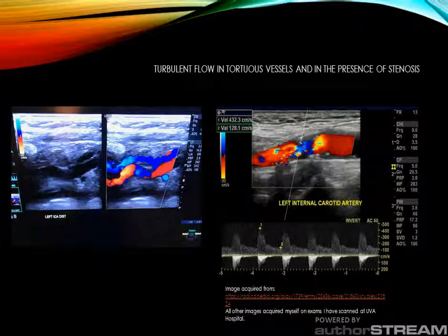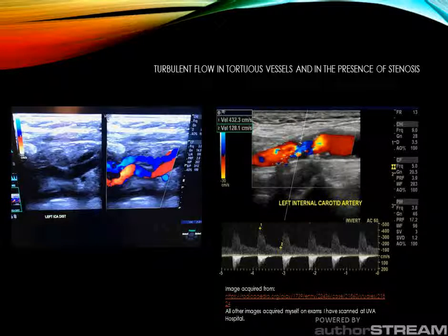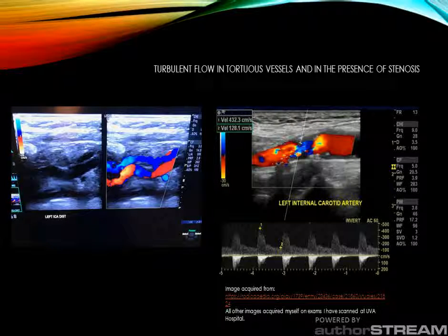We also know from flow characteristics of a stenosis in lesson 3 that upon the exit of a stenosis, turbulent flow is present, and distal to a stenosis, there is a lessening of velocity. This allows the return of laminar flow. I hope you enjoyed this presentation and it helped to solidify your understanding of flow patterns within the extracranial arteries.